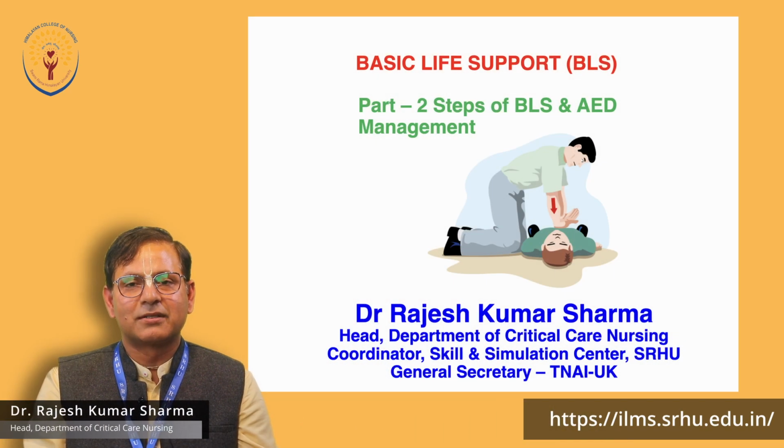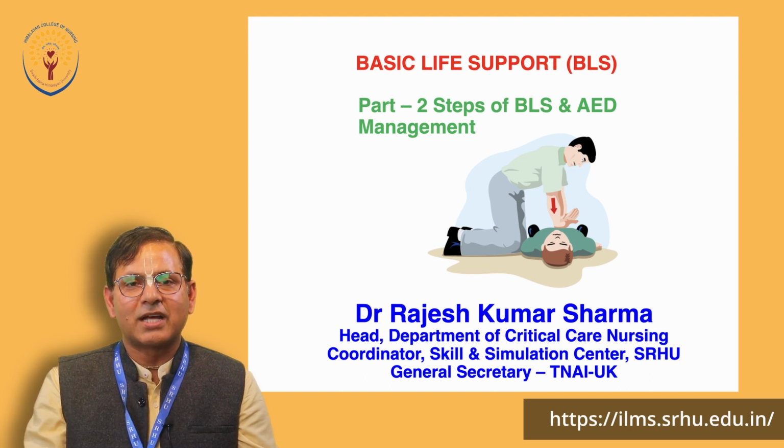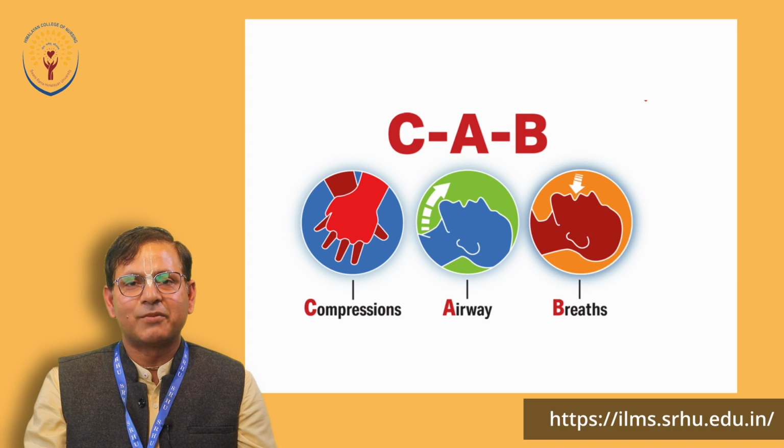In the previous module, we were discussing the assessment part during basic life support. So, in this module, we discuss what measures need to be done after assessment. In the last video, you have seen how assessment can be done.